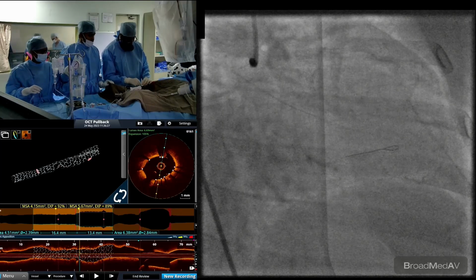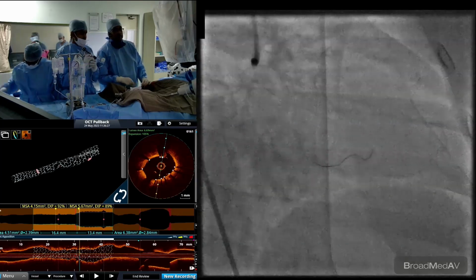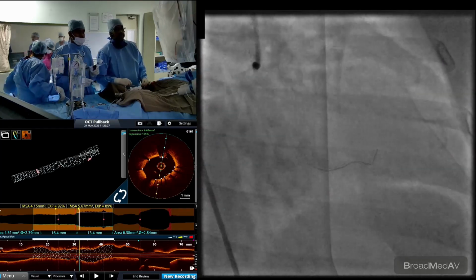Okay, so we've got the wire across. So thank you very much. And the idea was to show the LAD under OCT.